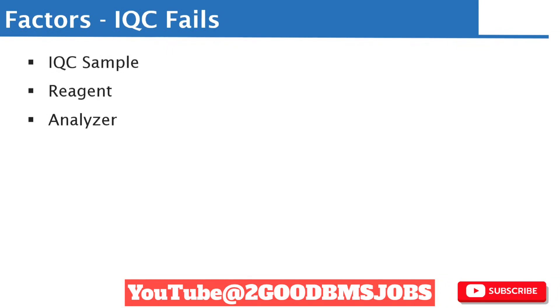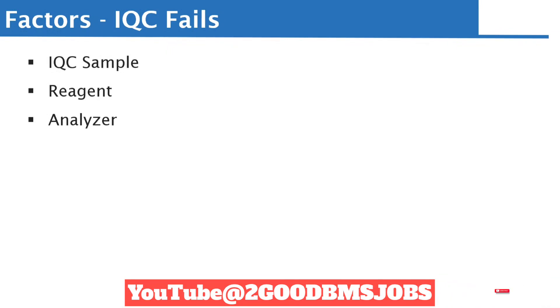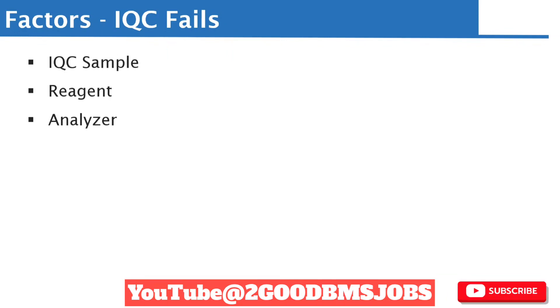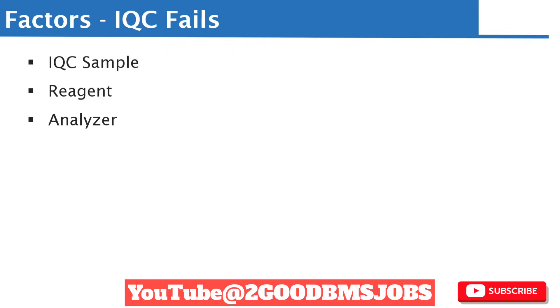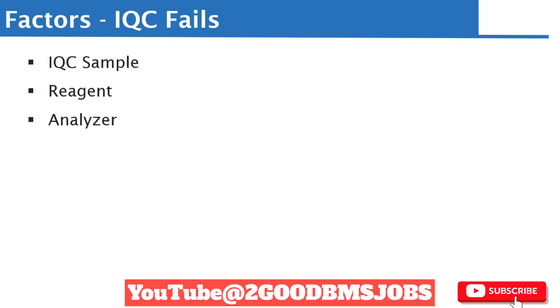Once you've done that, the next step is to look at what factors are likely to lead to the quality control sample failing. There are three main factors: number one could be the internal quality control sample itself, number two could be the reagent, and number three could be the analyzer. These are the three main factors associated with internal quality control sample failing.